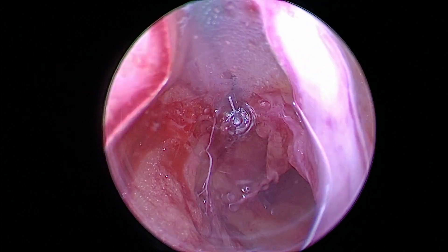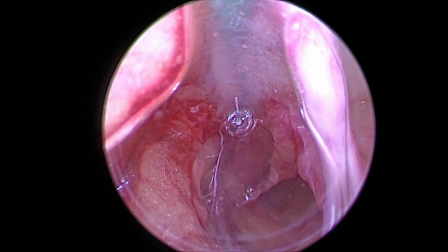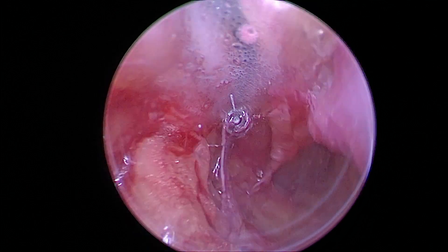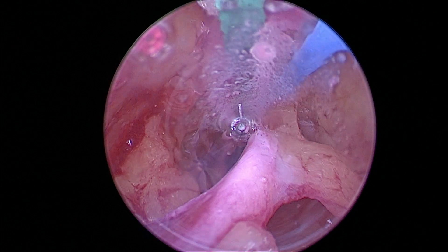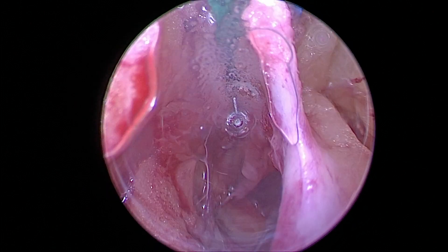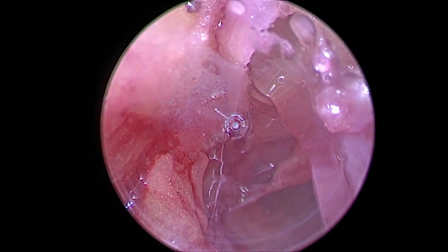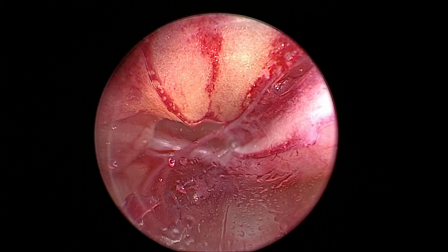Here's an anterior branch that I had cauterized once, and here's a second pullback on that. Sometimes you can just do a second pullback or move forward. Here I did a little rotation and pulled back, and that took care of the branch.